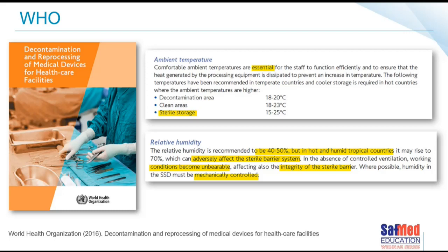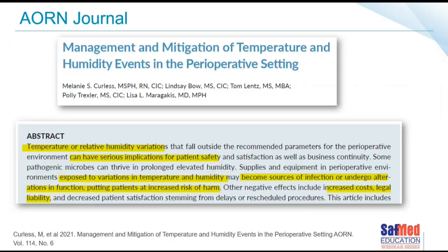I've been to many CSSDs where this is not the case. I've been to many CSSDs where, in fact, they used to have air conditioning, but it's broken, not functioning, and nobody's maintained it. So it is incredibly hot in some of those CSSDs, as you can imagine. And often the sterile storage area is not actually separated from the sterilization area itself. And as you can imagine, the heat from the autoclaves, from steam sterilizers, can really and truly ingress into other areas of the CSSD.